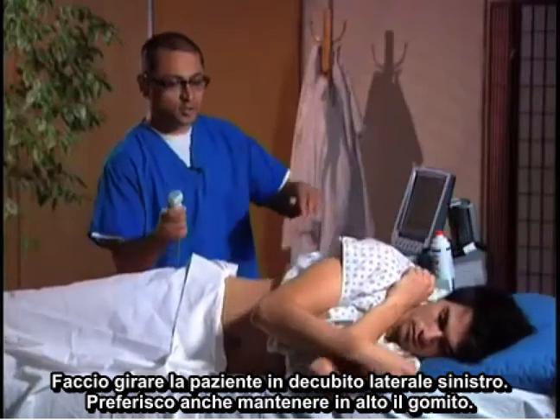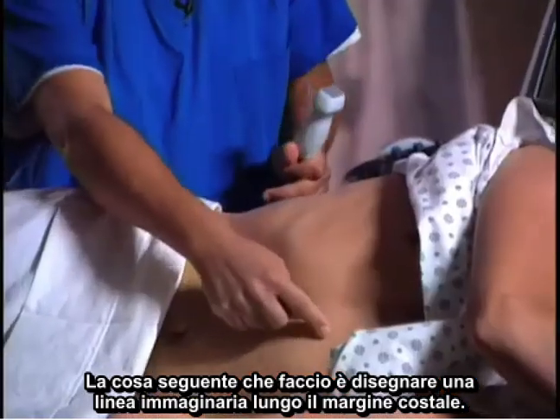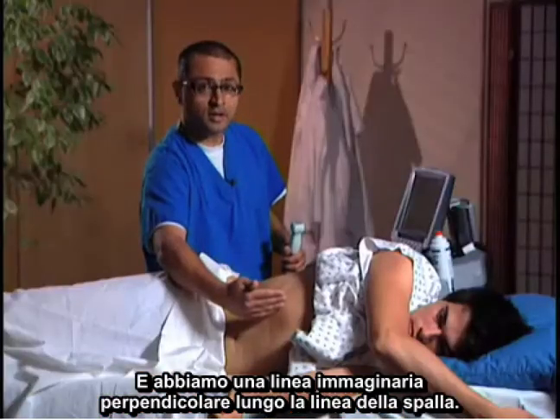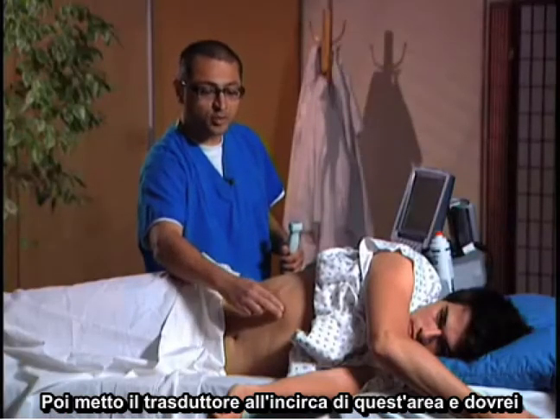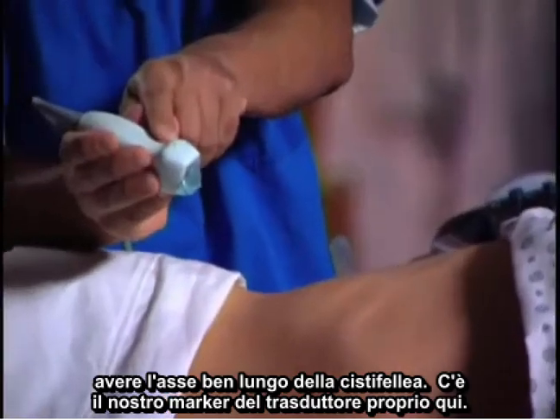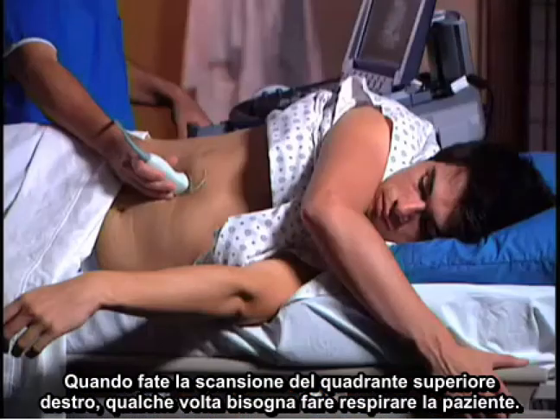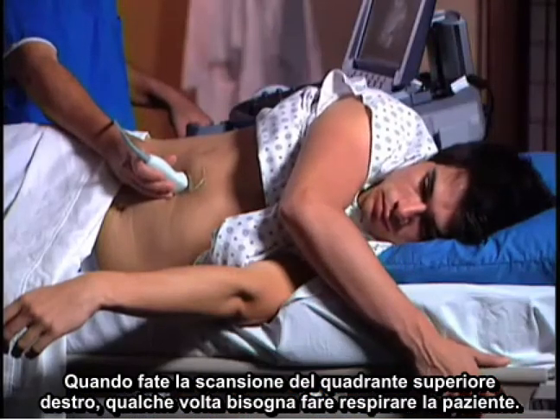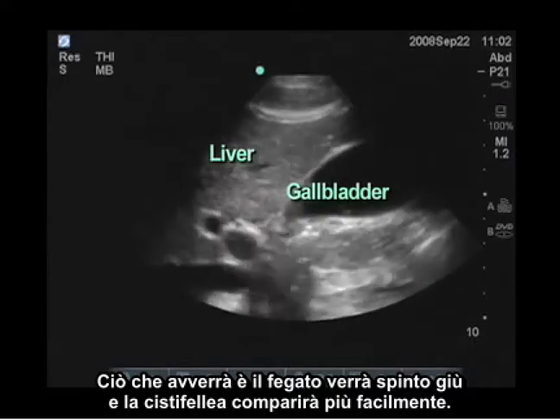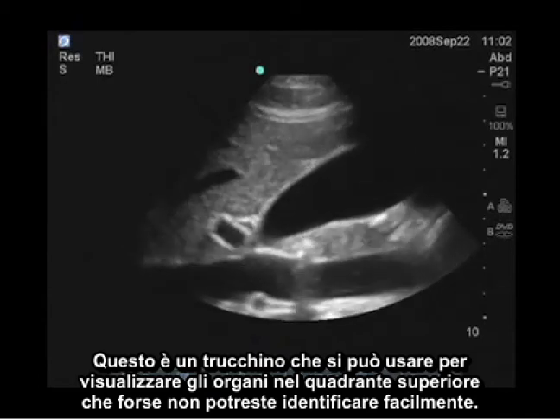I have the patient turn to the left lateral decubitus position and I like to have their elbow up as well. I draw an imaginary line along the costal margin and an imaginary perpendicular line along the line of the shoulder. I'm going to put my transducer right about in this area and I should have a very nice long axis of the gallbladder. When you're scanning the right upper quadrant, sometimes you'll have to have the patient take a deep breath — the liver will be pushed down and the gallbladder will come easier into view.